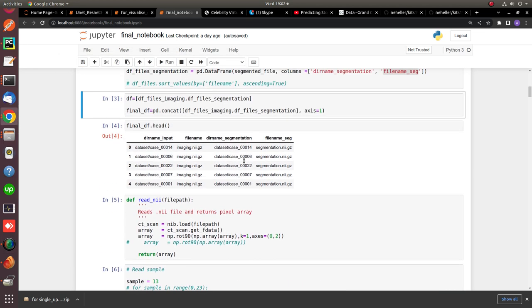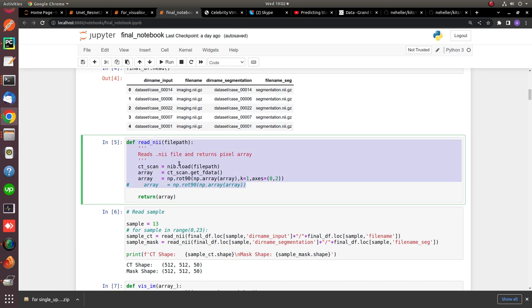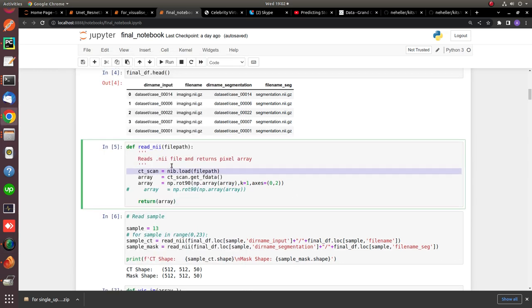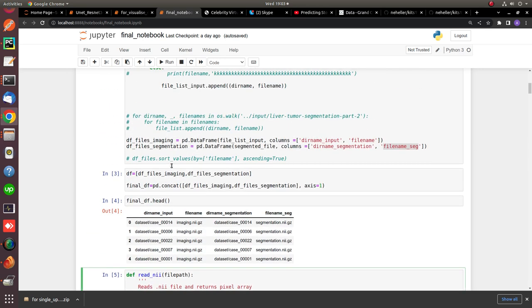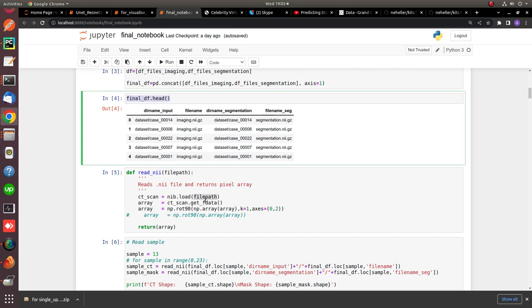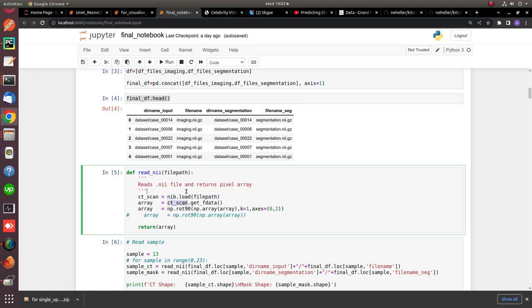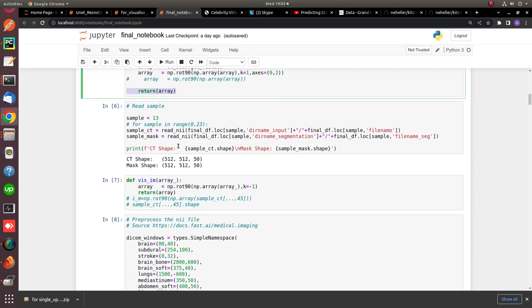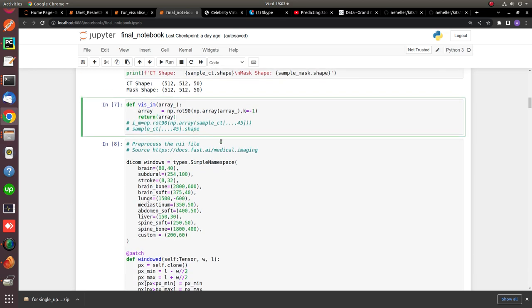This is the function for loading the NIfTI images. There's a library called nibabel available which enables you to read NIfTI images directly. You can download it the same way with pip install nibabel. Then you give the path from the dataframe — nibabel's nib.load will read the NIfTI files and then convert them into a NumPy array. You will then have the array of files from the NIfTI format.